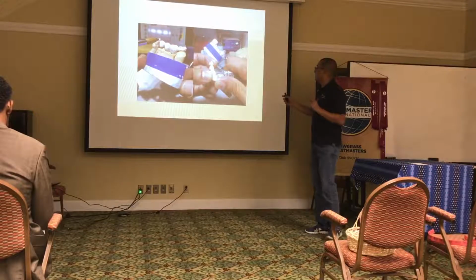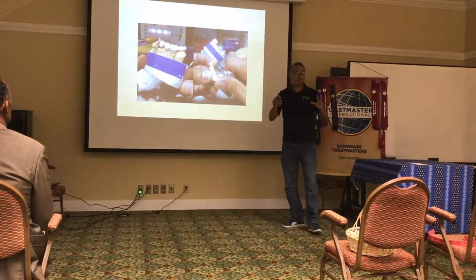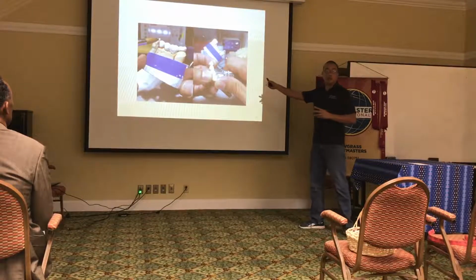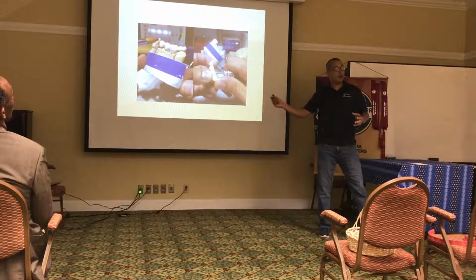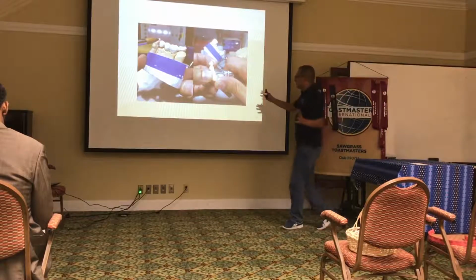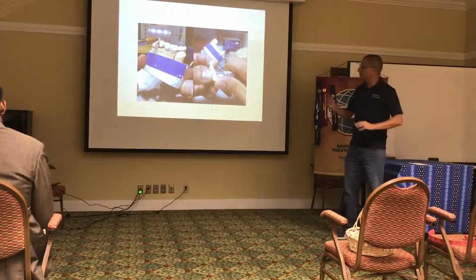Start building and everything. We put it in the oven. Well, you can't see the oven, but we put it in a special oven so we can cook it or bake. After that, once it's cooked, it gets hard, and then we take them out. And we start doing some grinding, adjusting the bite, the shape, and everything. And sometimes I get to do a little bit of manicure in there because it goes to sleep.